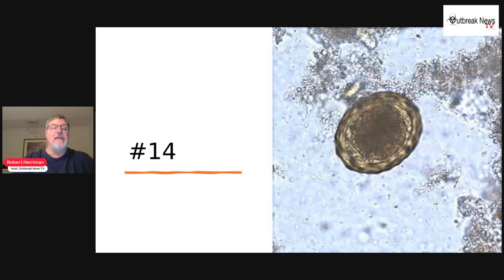Okay, fertilized and unfertilized stages of this parasite are passed in the stool of the infected host. The fertilized stage are rounded and have a thick shell with an external mammillated layer that is often stained brown by bile, as in the case of this picture. But in other cases, the outer layer may be absent, also, which is known as decorticated.